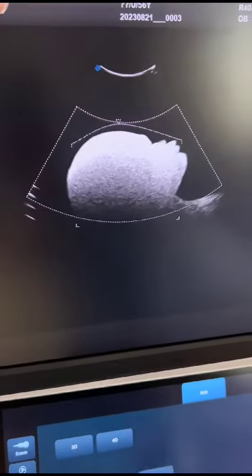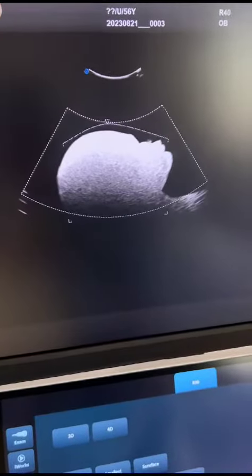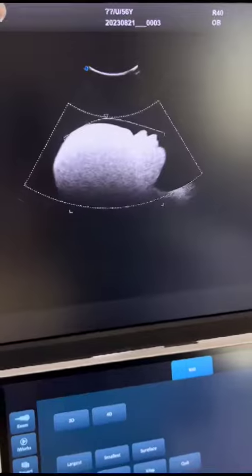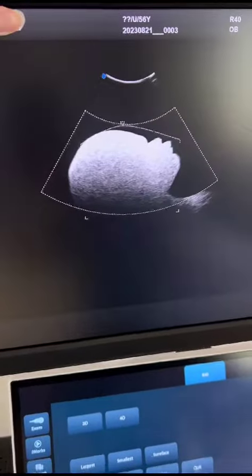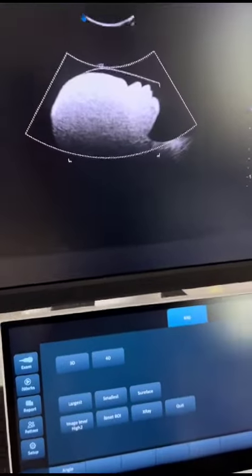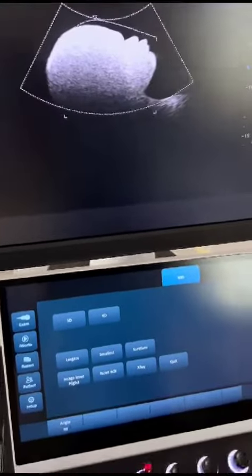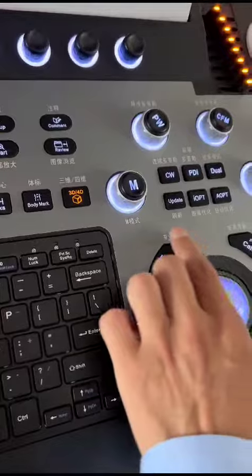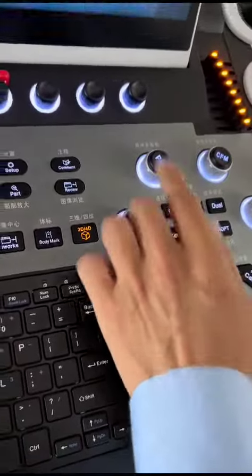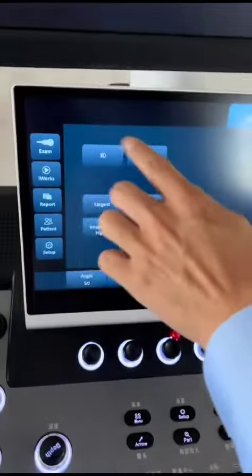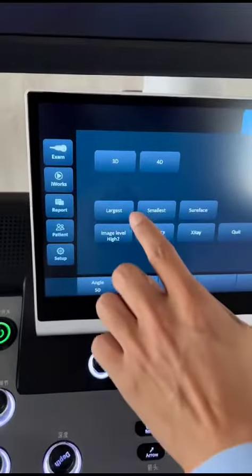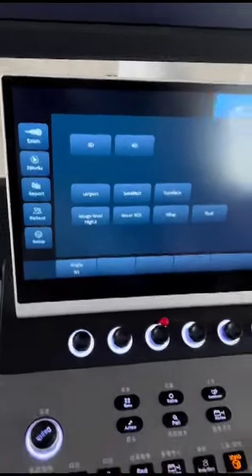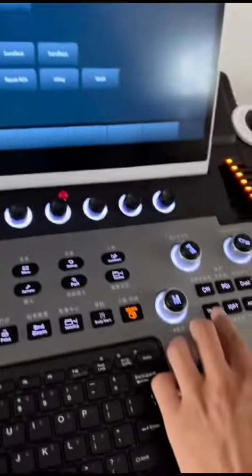Then press the update key, or you can press this 3D or 4D key. Press the update key.